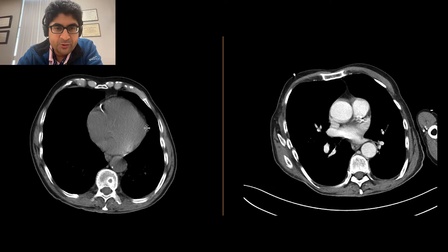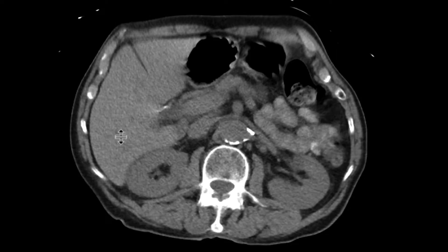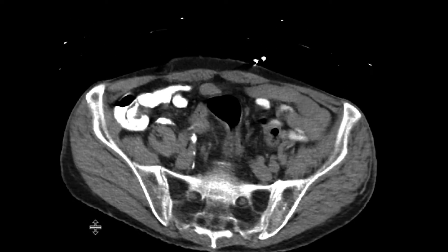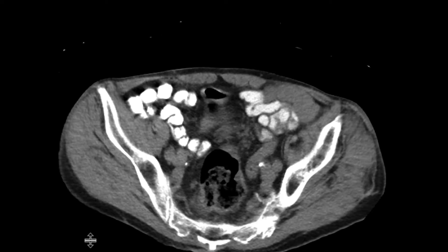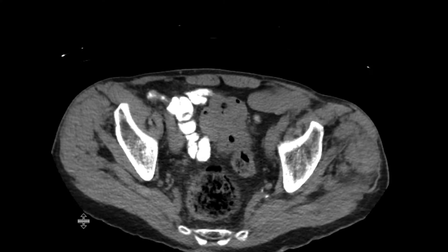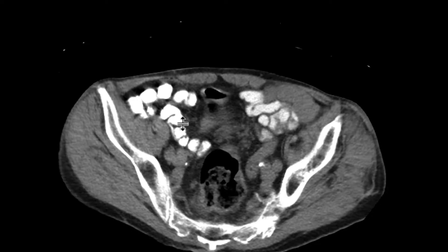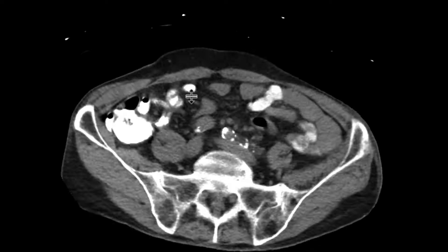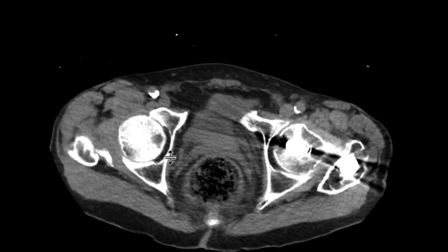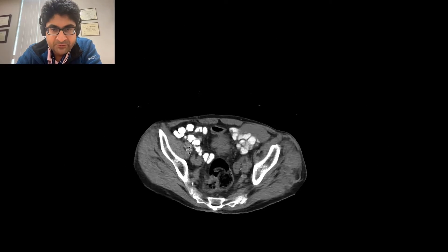This is a patient who had come in with some abdominal pain, and initially got a CAT scan without intravenous contrast, with a little bit of oral contrast as well. As we scroll down, you can see that in the region of the sigmoid colon, there's a focal area of thickening. It really does look like there's a soft tissue mass here, and certainly a colonic mass — a colonic neoplasm was questioned — and perhaps that was causing the abdominal pain, but there were no real acute findings in this patient.